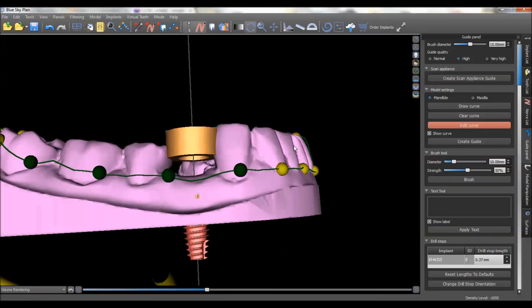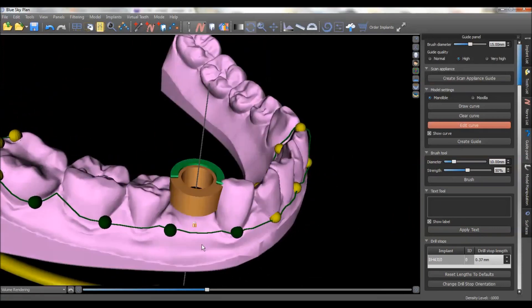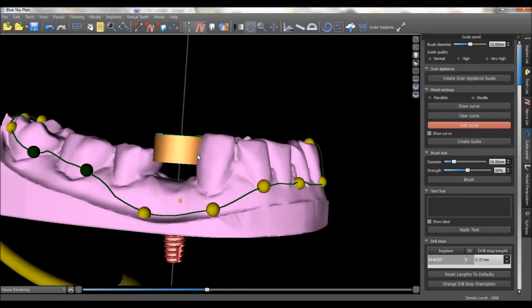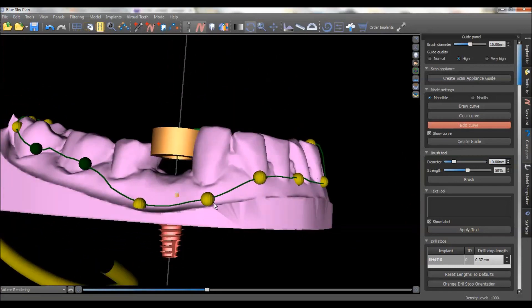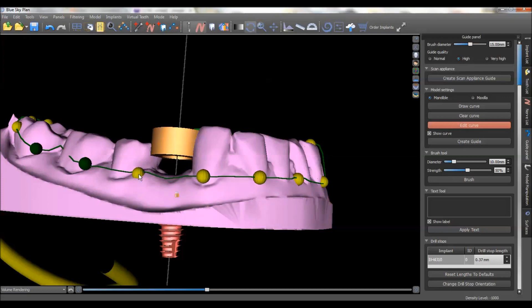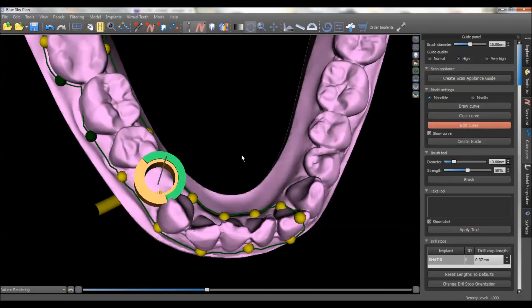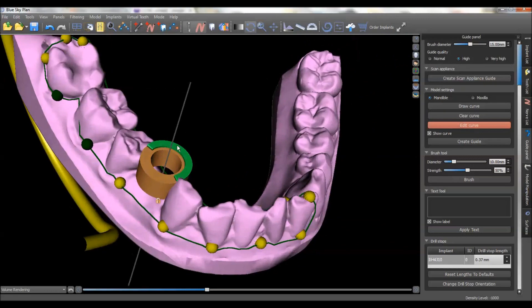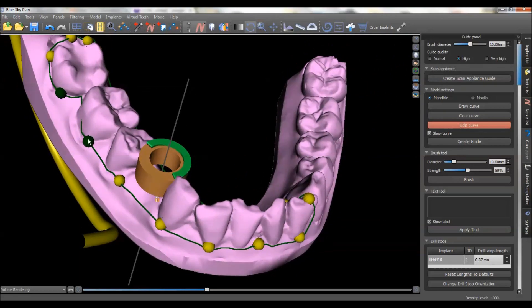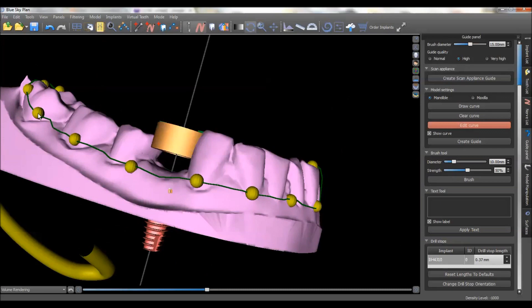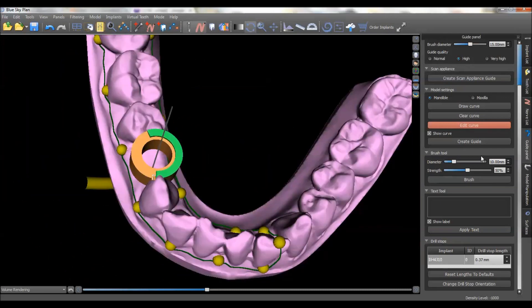That looks pretty good. Now, I like to flap when I do my guides, so I don't want the guide edge to be way down here because there's no way you can retract a flap out from under it. So right in the area where I'm going to be, I make it a little bit shallower, and I make sure I can look straight down from the top without impinging on that. Everything looks good here — we'll push 'Create Guide.'